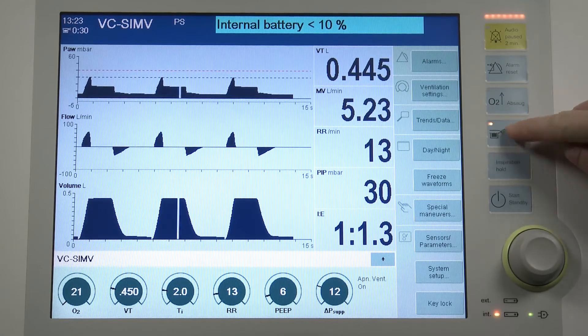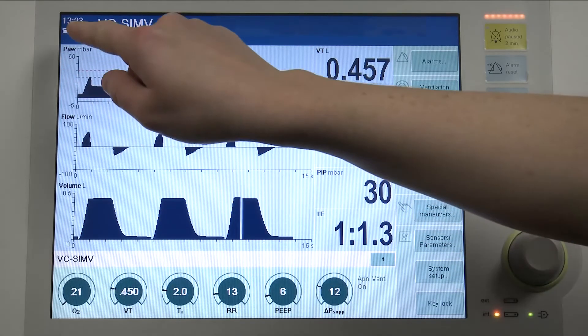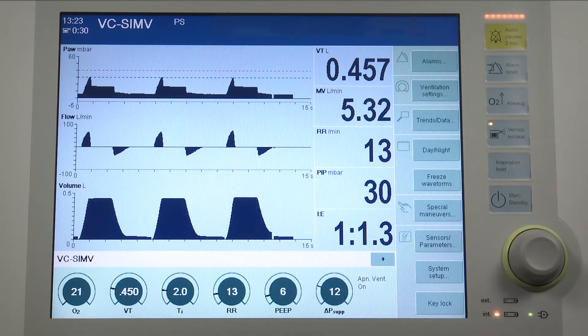Press the nebulization on-off key and Savina 300 starts nebulization. The nebulization time is 30 minutes. The symbol and the remaining time are displayed in the header bar.